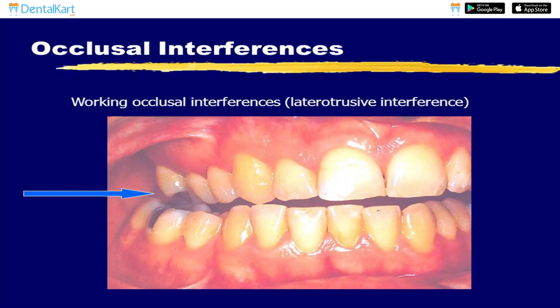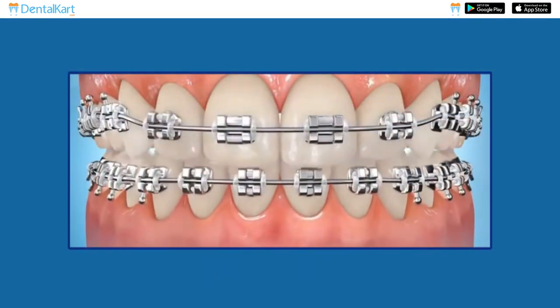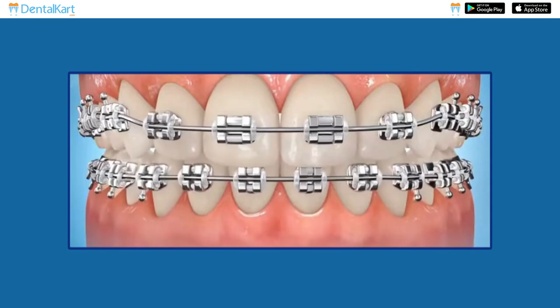They help in eliminating occlusal interferences, allowing for unobstructed tooth movement and improved treatment outcomes.